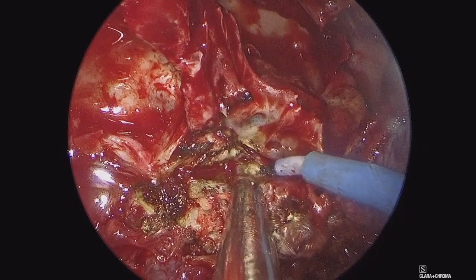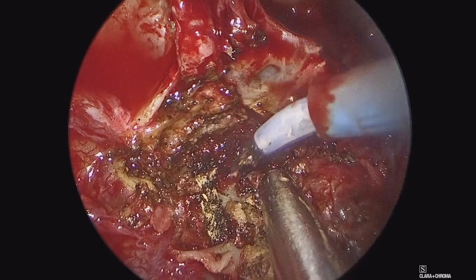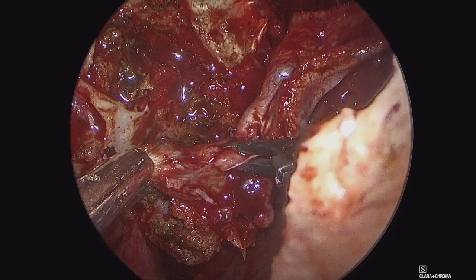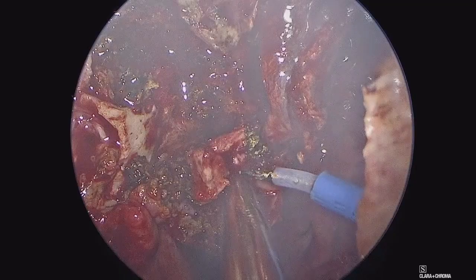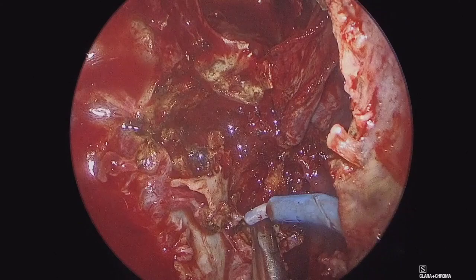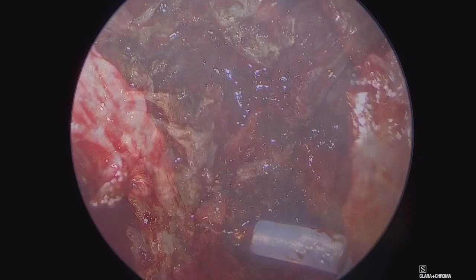Here we are now better exposing the pterygoid process of the sphenoid bone, which contributes to both the medial and lateral pterygoid plates as well as the pterygoid body, or pterygoid wedge. More inferiorly in that area you'll see the palatine bone, in particular the perpendicular plate of the palatine bone, where it forms a wall of the nasal cavity up to the sphenopalatine foramen. Here we are working through that junction of the pterygoid wedge, taking additional tumor with a cautery. We'll work back towards the nasopharynx, then excise through the sphenopalatine artery — with really no vascularity through it due to our excellent preoperative embolization — giving us nice visualization of the perpendicular plate of the palatine bone as it articulates with the pterygoid process of the sphenoid bone.